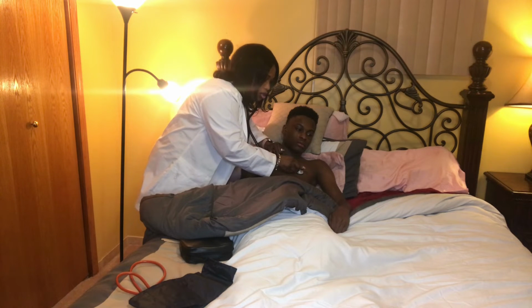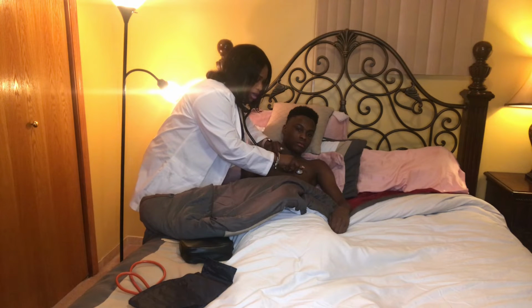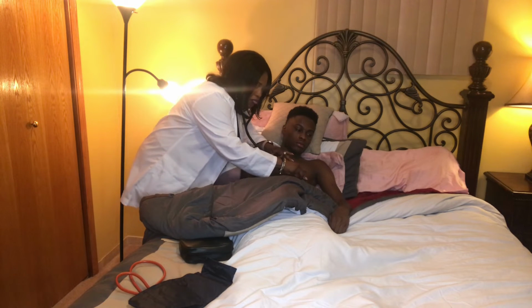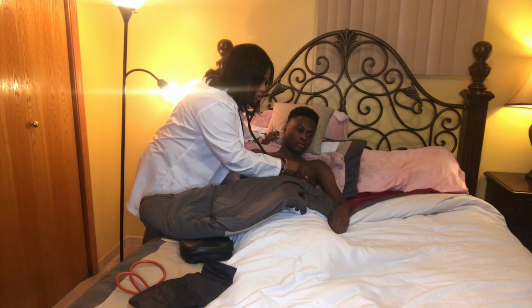And on the third intercostal space, I can listen to the Erb's point. So as I'm listening, and also I move my diaphragm down to the fourth intercostal space, where I listen to the tricuspid valve.